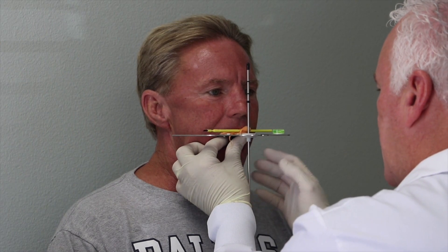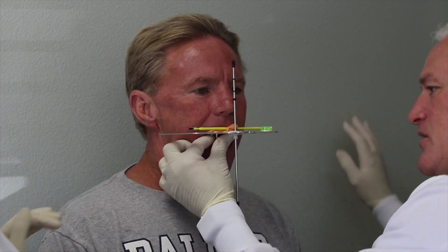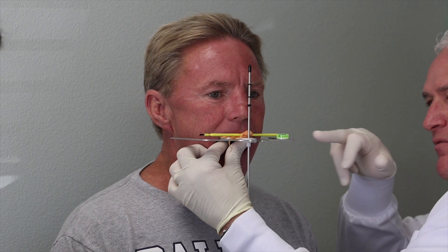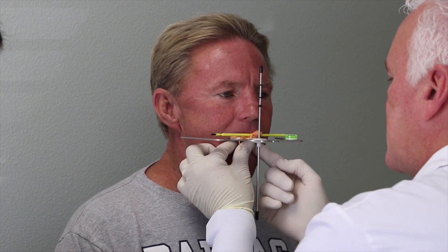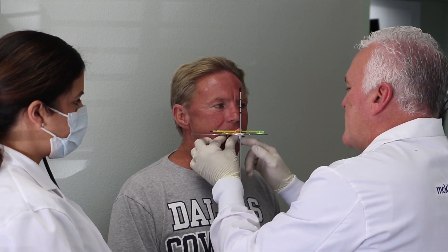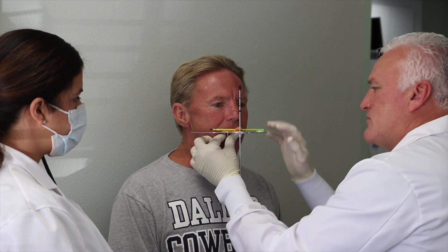The midline will be right in this plane. I want this parallel to this one, kind of parallel to the wall, and equal distance between this vertical line. It's setting up nicely. My little bubble is right in the middle here, so I know we're level on our bubble level.